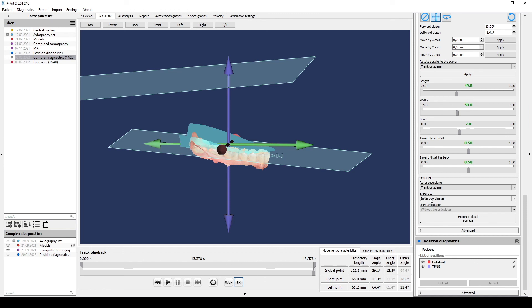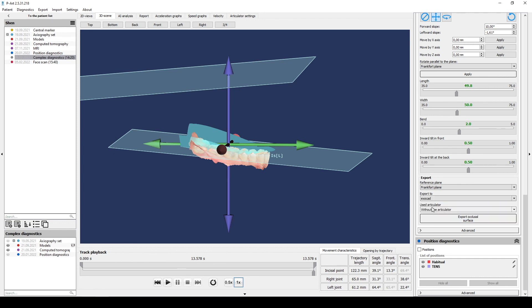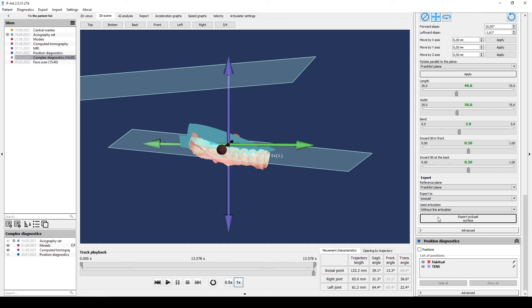Then select program which you will work with: Exocad, Zirconzahn, Ceramill, in lab or initial coordinates. Select articulator and click Export occlusal surface.